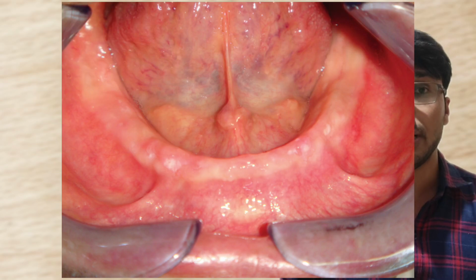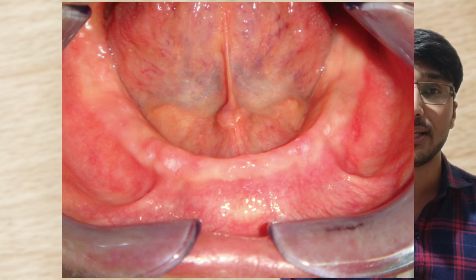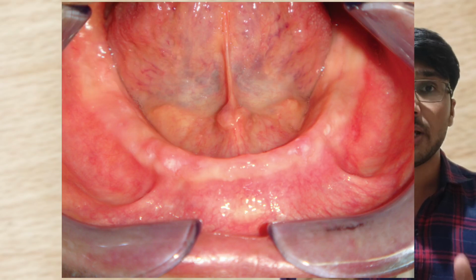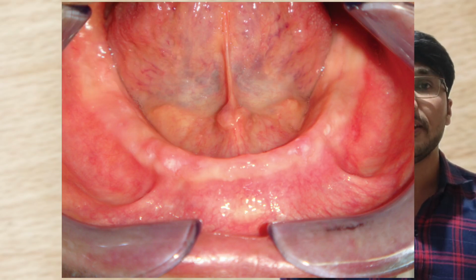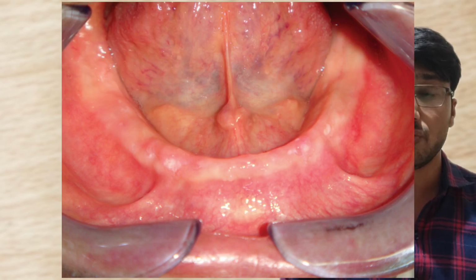We have to observe the oral cavity of the patient, retract the cheek and carefully observe the limit of the labial sulcus and the buccal shelf area. Retract the lips to see the extent of the labial notch. Similarly, feel the depth of the lingual sulcus with your fingers. You will get some idea.